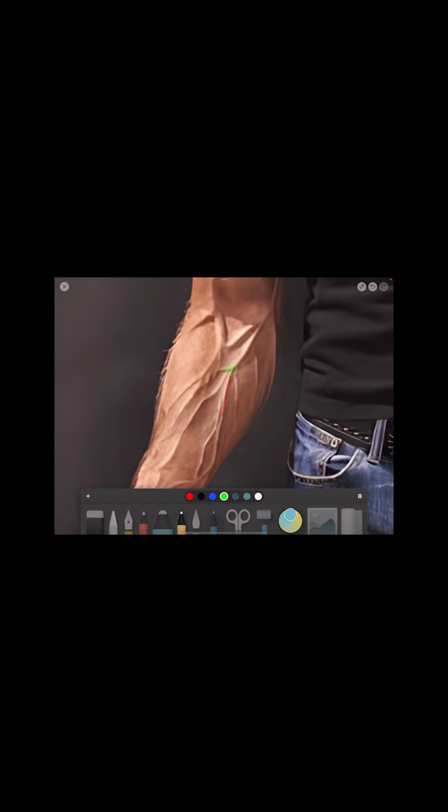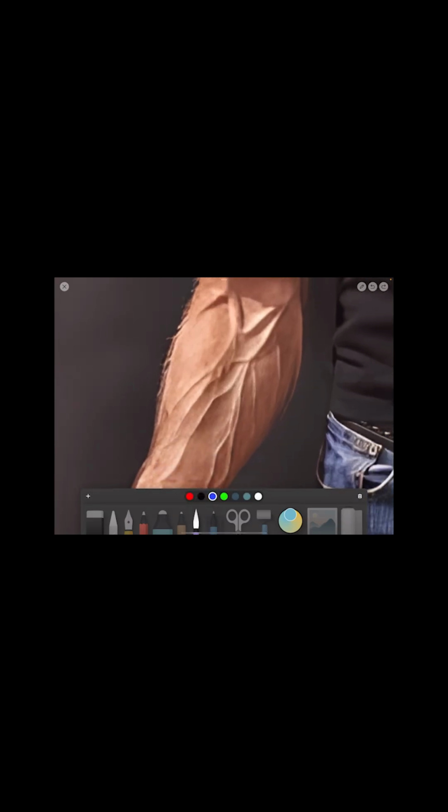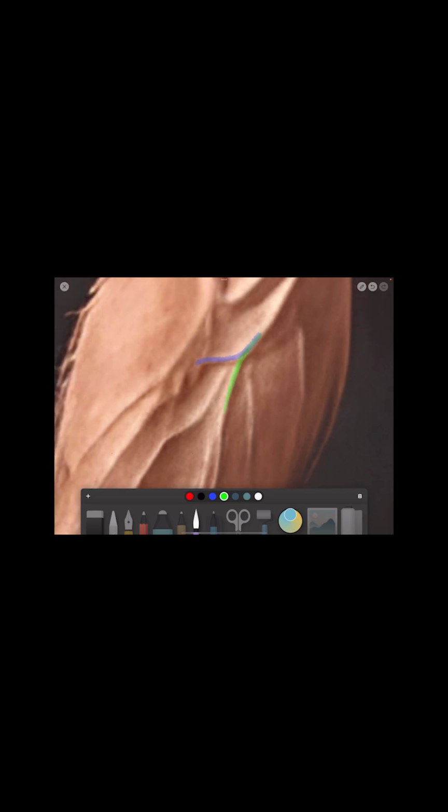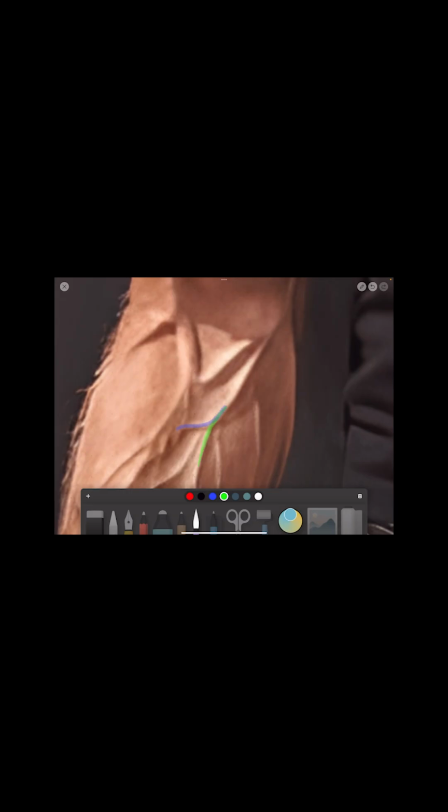So right before it joins, I tried to get my catheter tip to stop and exit right before that conjoining junction. And the reason why that's so important is we are trying to allow the flow from the blood, from the collateral branch, to dilute the medication. So by the time it gets up to this junction right here, it'll be diluted by the blood.